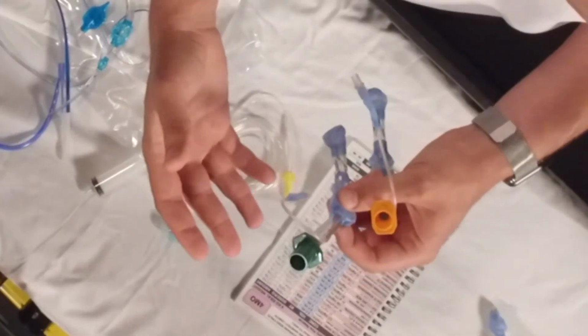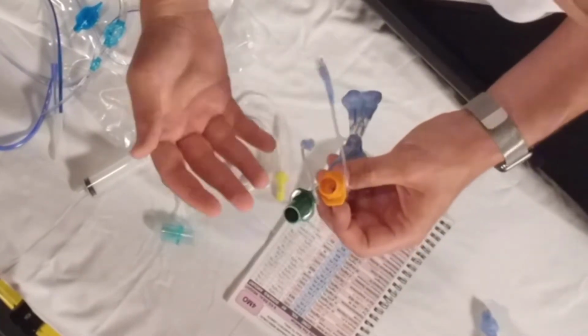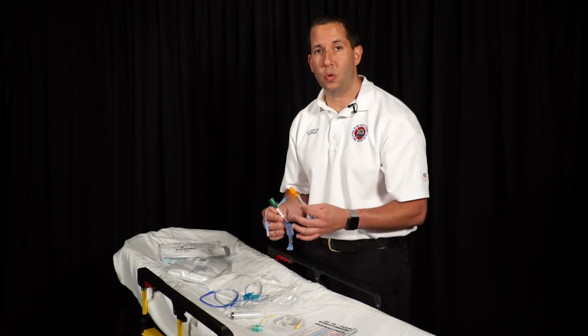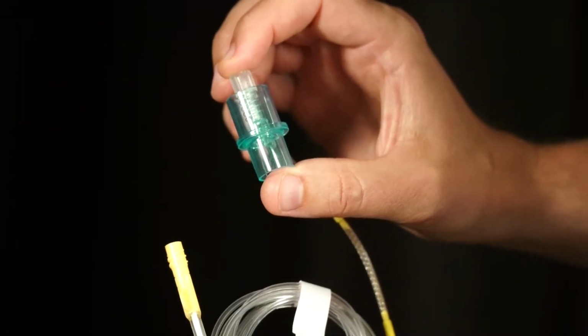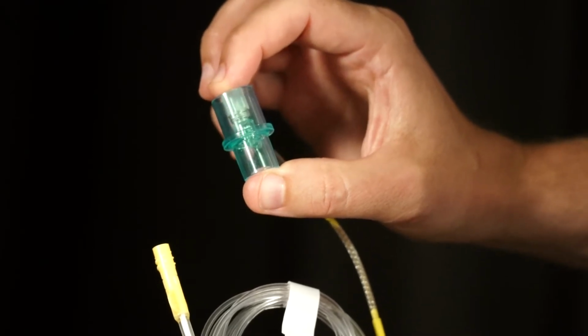Now they do make these 2 King Airways with the gastric access port, and through attrition, after we get rid of this stock, we're going to be receiving the 2 and 2.5 with the gastric access port. So that's the size 0. The size 1 is the same thing. The same contents come in the bag with the exception of the actual neonate inline filter.